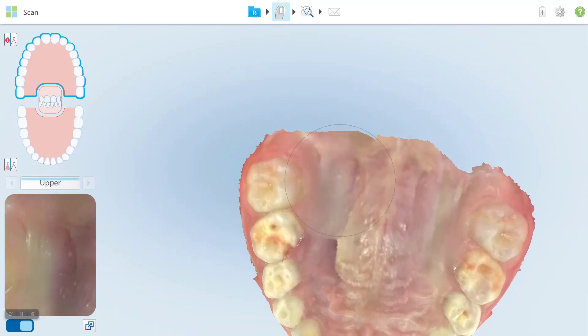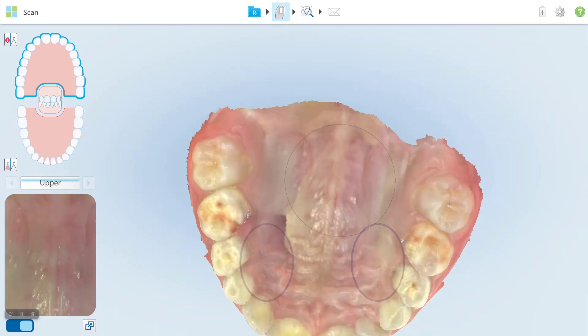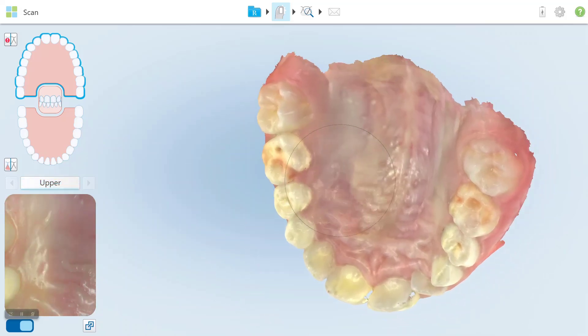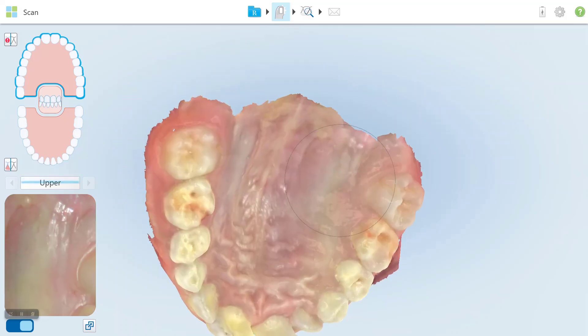To complete the palate scan, fill all the voids on the left and right sides of the palate that are visible from an occlusal view. Ensure the entire palate is scanned.